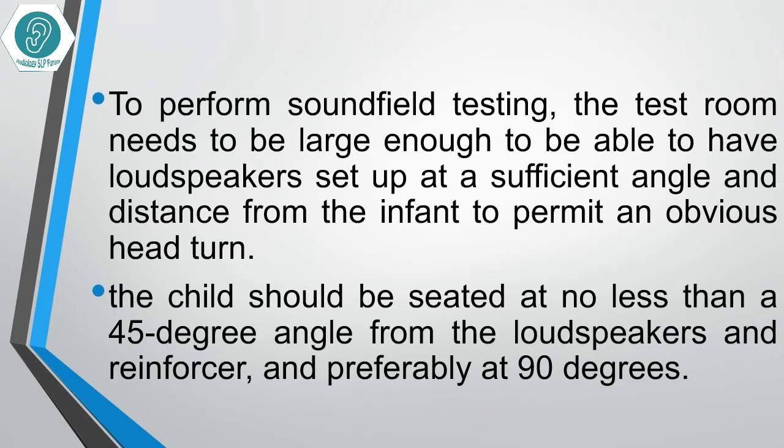To perform sound field testing, the test room needs to be large enough to have the loudspeaker set up at a significant angle and distance from the infant to permit an obvious head turn. The child should be seated at no less than a 45-degree angle from the loudspeakers and reinforcer, and preferably at 90 degrees.